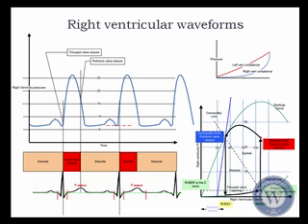in the pulmonary artery. So this ventricular waveform is what actually generates the displacement of volume out of the right ventricle into the pulmonary circulation. So you really have to at least minimally reach the highest expected pulmonary artery pressure, or exceed it if you have things like pulmonic stenosis. What you end up having eventually is that the end of systole occurs here. Okay, this is when the aortic valve, in this case the pulmonic valve, would close, and we'll show this later on when we put the PA catheter reading on top of this. You can see your pressure over time curve here.